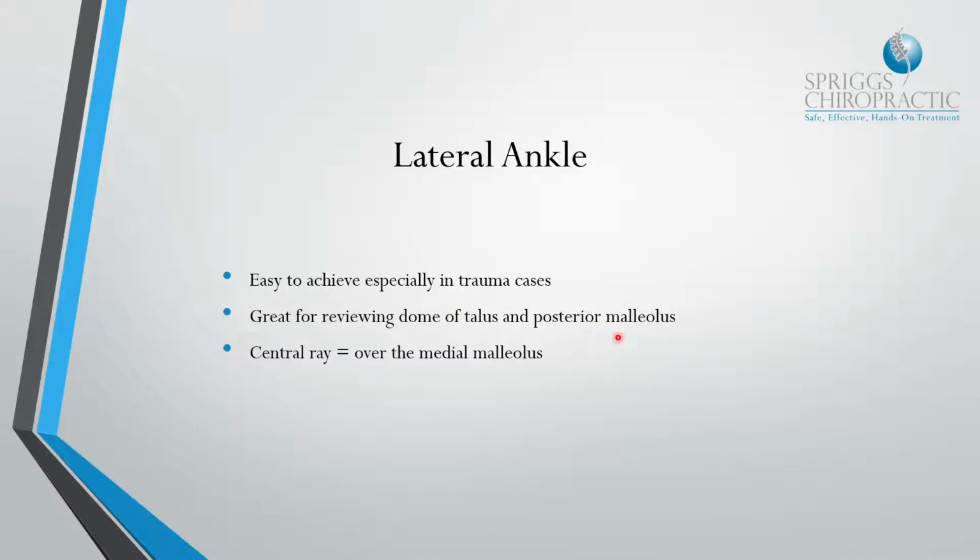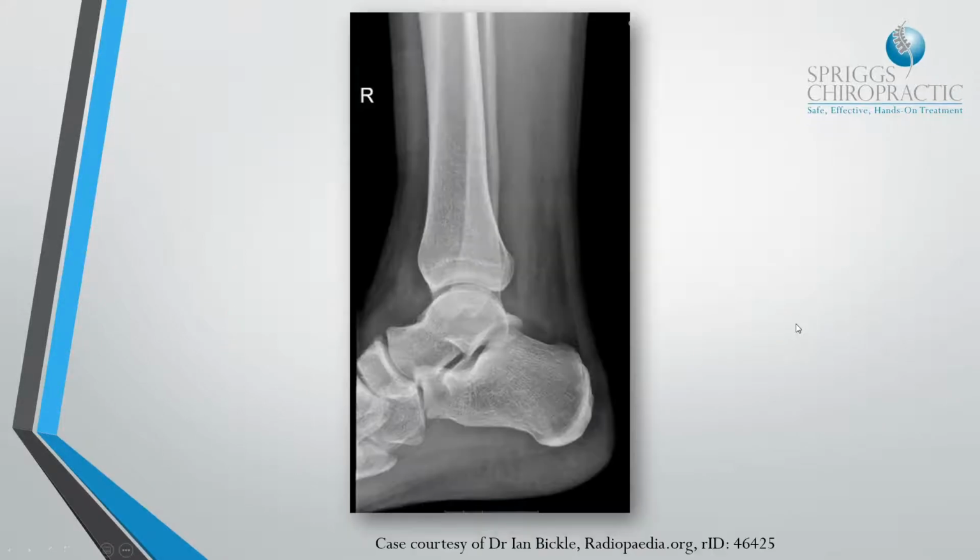So there is a posterior malleolus, and you can have a trimalleolar fracture, where you have a fracture of the medial, lateral and posterior malleoli all at the same time. So that's going to be something you'll go through in the trauma series. Central ray is the medial malleoli.